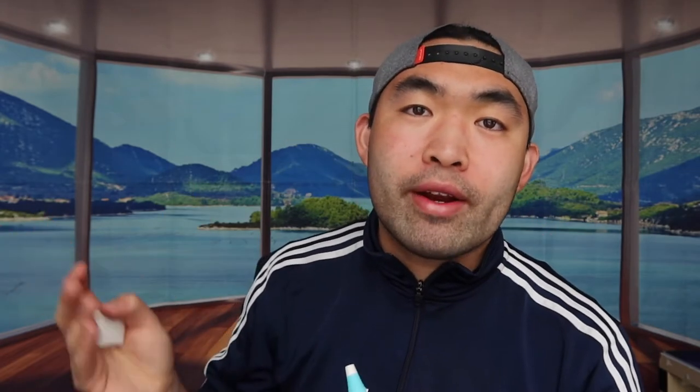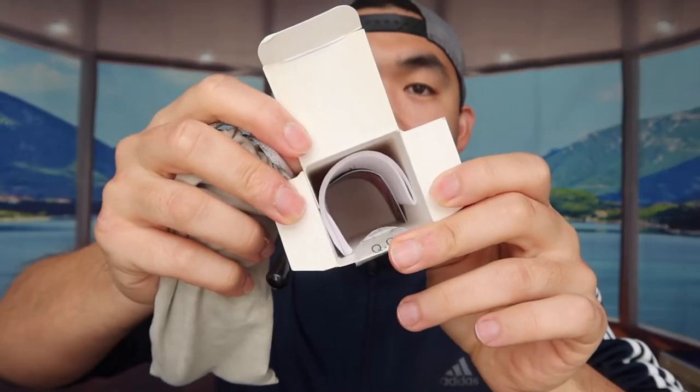This one basically works the same way — press the button near your forehead and check the temperature quickly. It reads 96.9. If you want to use the ear option, just pull the cover open and you have the ear port right there. Put it into your ear and check the temperature. I recommend getting ear probe covers for this option — I won't demo that right now to keep things clean, but it's straightforward.